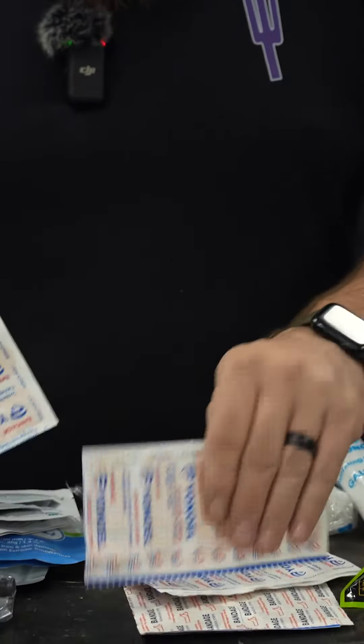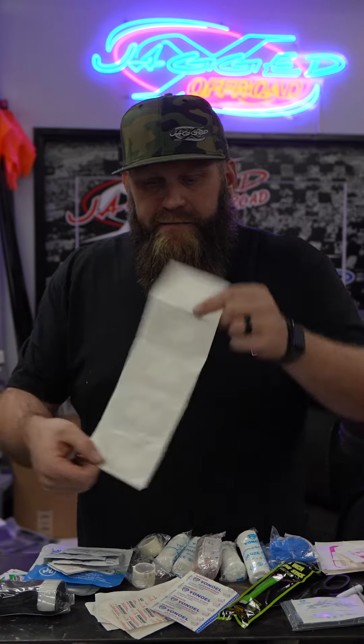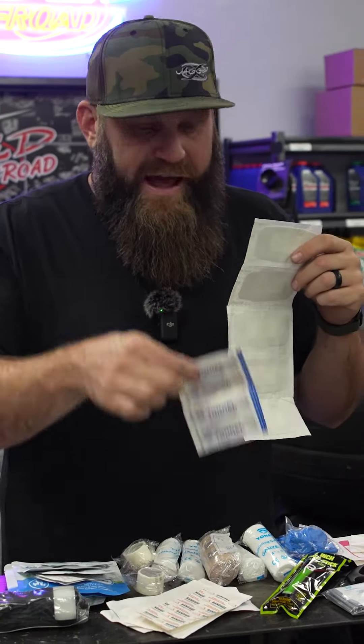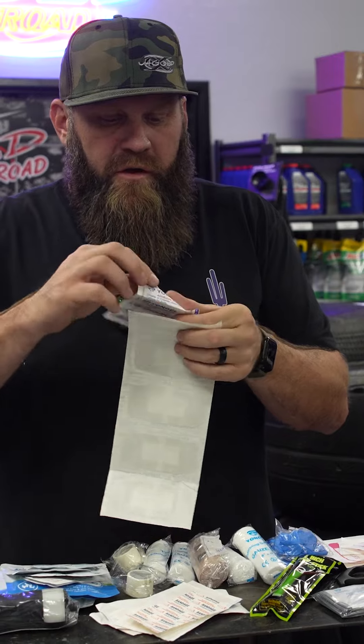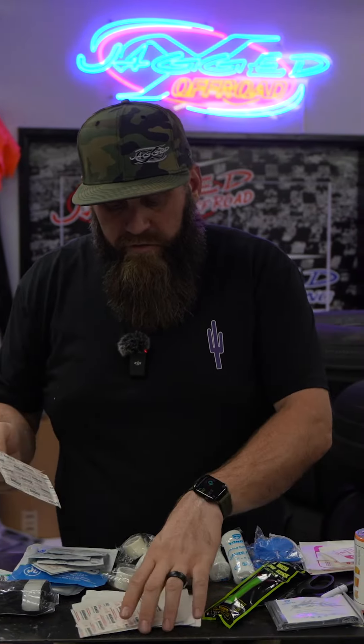There are a lot of assorted bandages — these are your standard bandages. These are a little bit smaller. We have butterfly bandages, and then also really big ones for knees, elbows, and stuff like that, plus bigger butterfly bandages. So a lot of different bandage options to keep you covered.